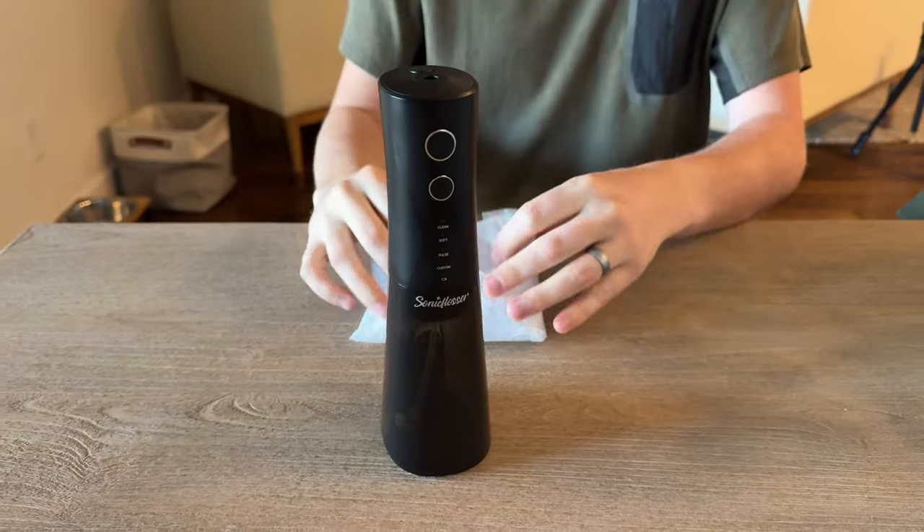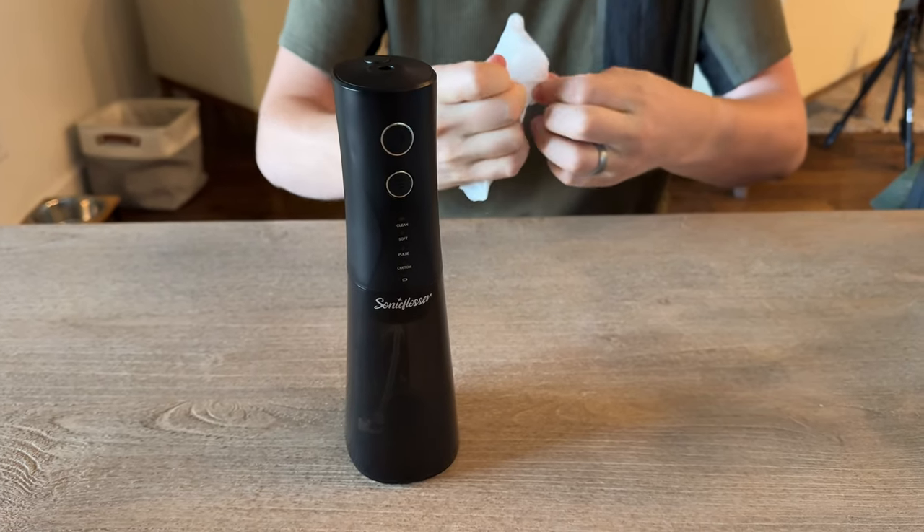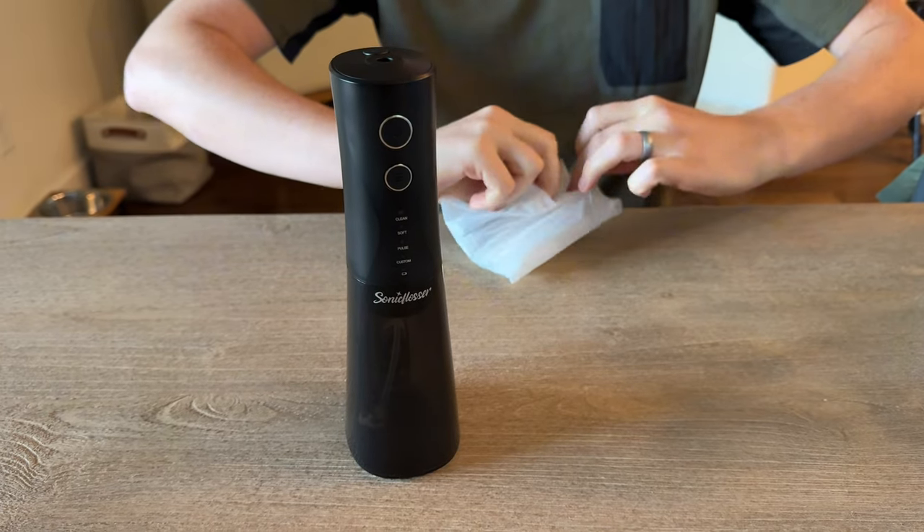It's a nice unit. It comes in black. These must be all the components that come with it.